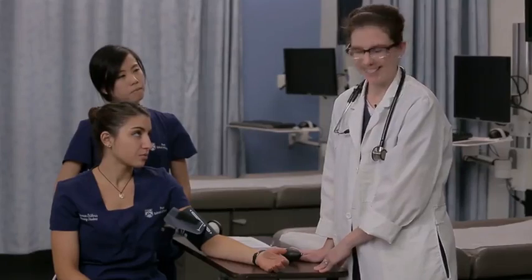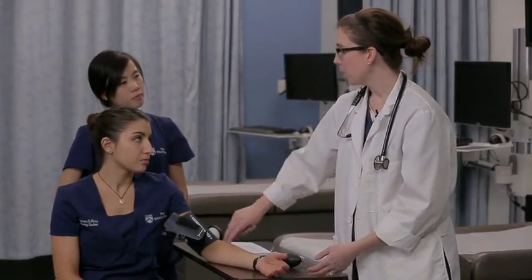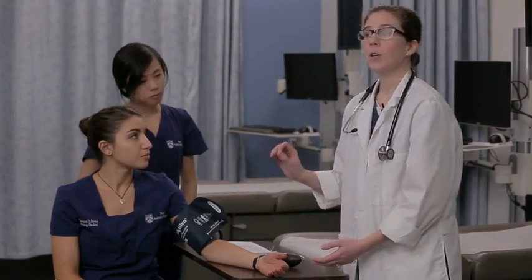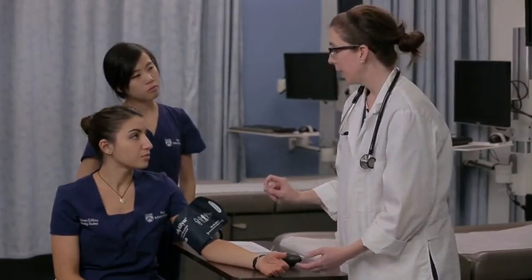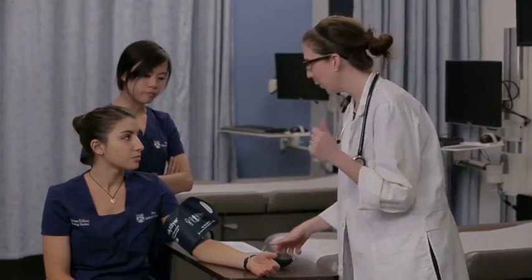Sometimes when I have my blood pressure checked, my practitioner has my arm down at my side. Does that make a difference? Well, that's a very good question, Dr. Skanga. Ideally, you want to take the blood pressure in the left arm and have the left arm supported so that the cuff is as close as possible to the same level as the heart — that will give you the most accurate reading. Sometimes we're pressed for time, we know a patient's history and that they don't have a blood pressure problem, and we might not have the ideal setup. So we do the best that we can to be accurate.